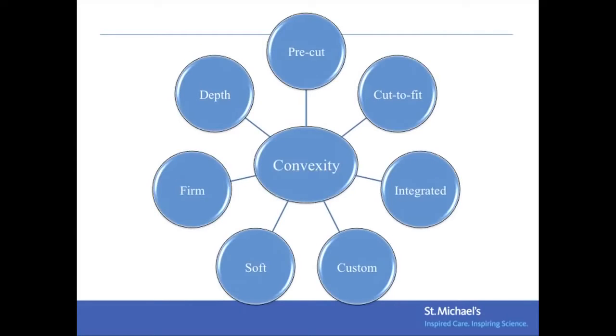These properties include pre-cut versus cut to fit, integrated versus non-integrated, the amount of tension applied to the peristomal plane, whether it's soft or firm, the number of depths or degree of depth, including whether you're using stacking or building convexity on your own.